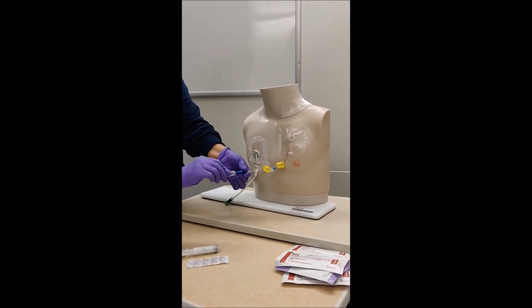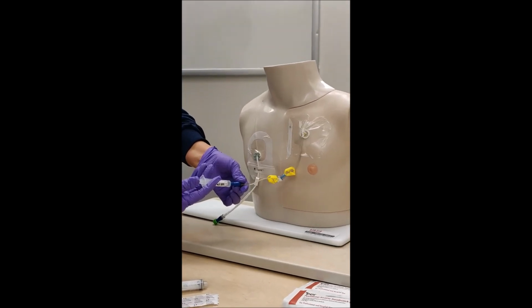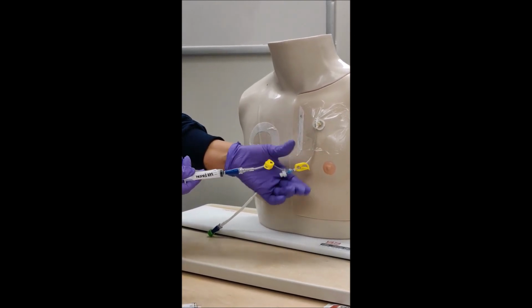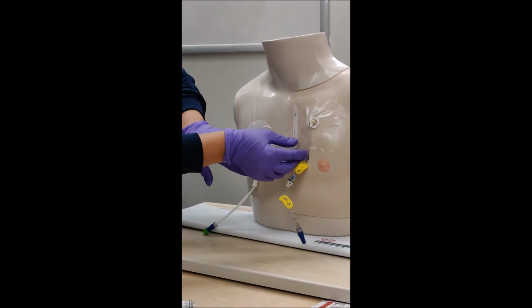I'll put my heparin in. Okay. Clamp. And now I'm ready to peel off the dressing.